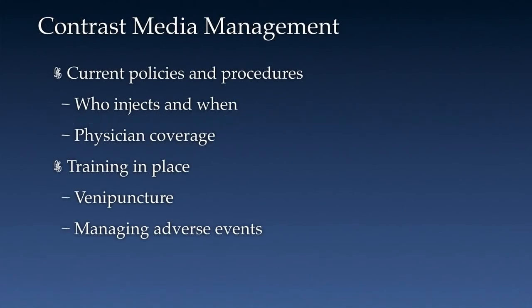With regards to contrast media administration, do you have current policies and procedures that address, among other things, who can inject and when? Now, based on your country, do you have requirements with regard to physician coverage? If the technologist, radiographer, or other MR personnel may administer a gadolinium-based contrast agent, is there formal training in place? Even if the technologist or radiographer does not administer the contrast media, is there a formal and documented education program which addresses recognizing and managing adverse events?